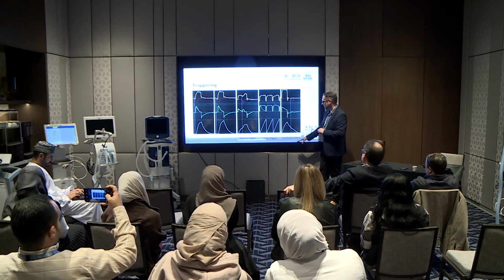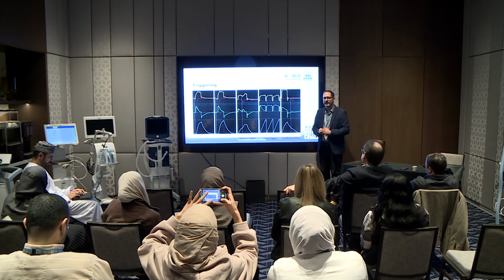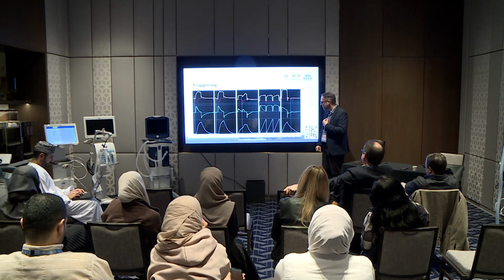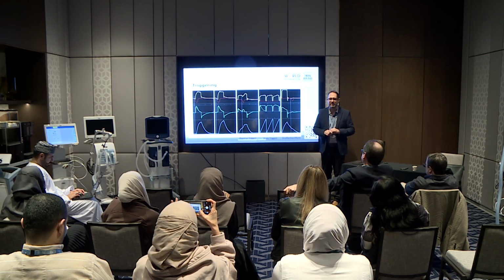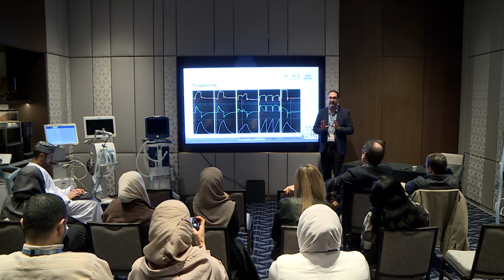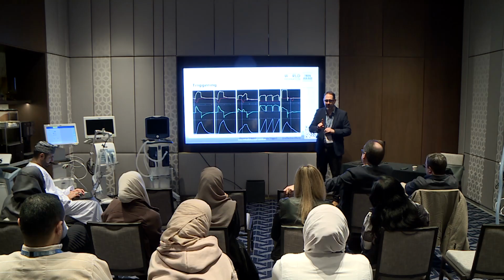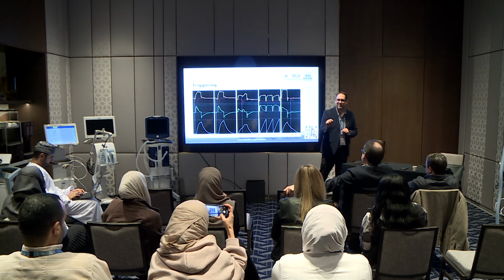And then this is fail trigger, what I refer to as ineffective effort. I'm going to tell you why I call it ineffective effort: although the patient's making an effort here and they're not triggering the ventilator, I find over the years calling it ineffective trigger makes people think they have to adjust the trigger sensitivity on the ventilator. And that is the last thing you need to adjust in the ventilator, unless someone has set it inappropriately. But if they trigger this breath, no problem, and then they miss this one, the problem is not the trigger sensitivity. I'll tell you what the cause is, but it's not the trigger sensitivity.